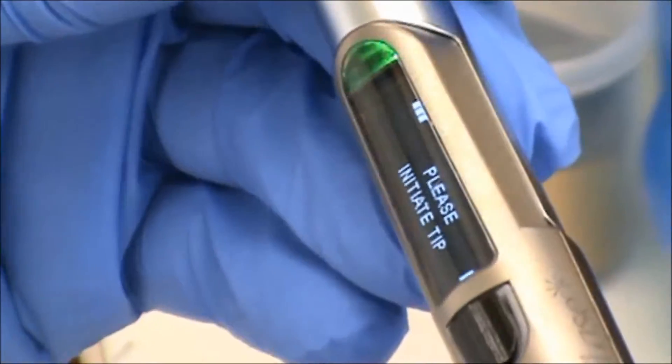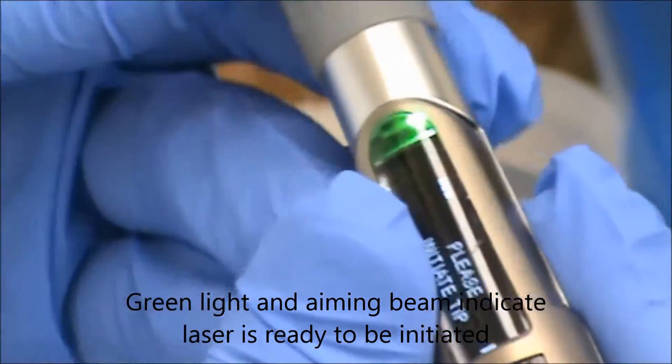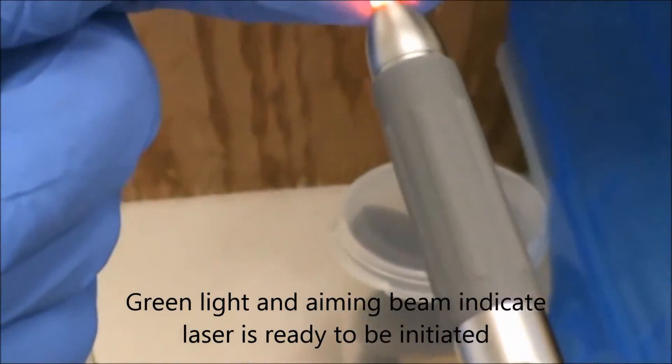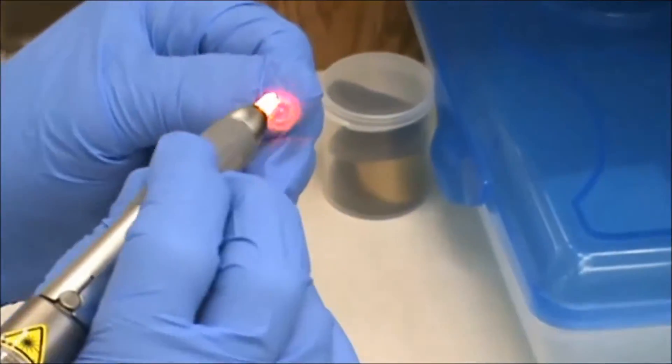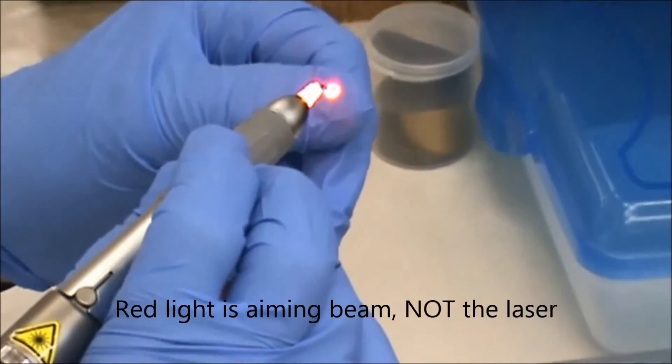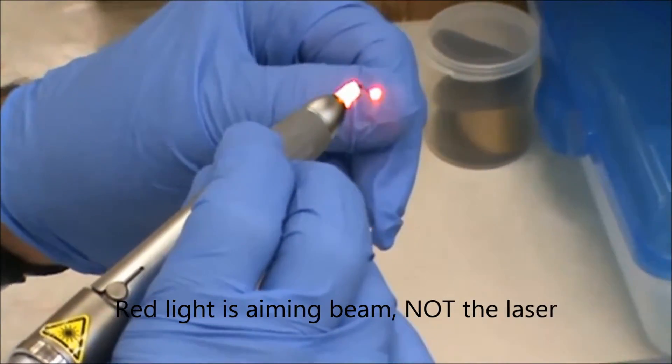And it's going to ask us to initiate the tip. The green light and the solid glowing red indicate that it is ready to fire. But at this point in time, the red is just an aiming beam. It is not emanating any laser energy.